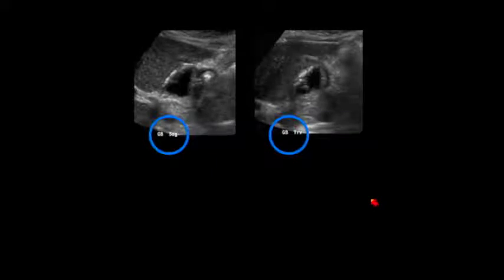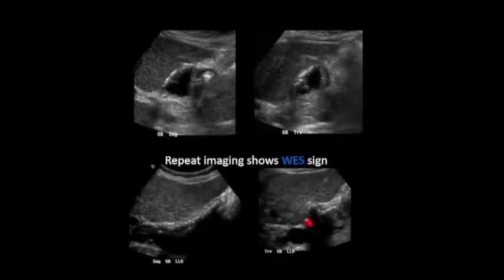Okay, other problems. Here we go. This one's labeled gallbladder sag, gallbladder transverse. Is that the gallbladder? Well, it's a little odd that it didn't really change a whole lot in shape between the two images. There is fluid. There's something a little bit bright in there. So again, go back in, work at it a little bit more, and lo and behold, we found the gallbladder.